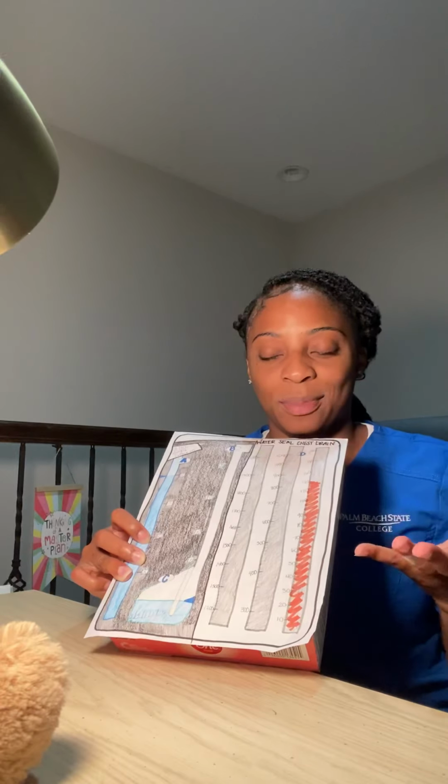I would monitor my patient's drainage system about every 2 hours, just to keep track and know exactly what it is that I'm finding. I would also note the color of the drainage. What type of drainage is it? Purulent, serosanguinous. What type of drainage I'm getting out. I would also note that in my nurse's note on my patient's chest tube.